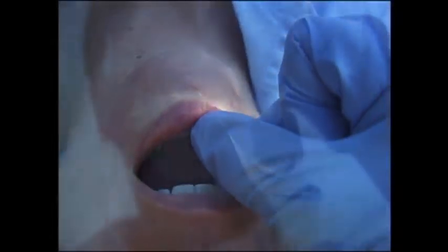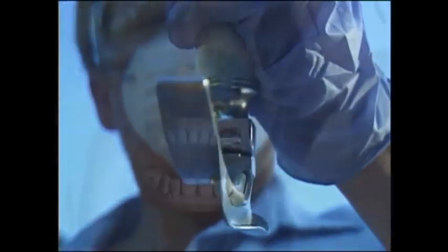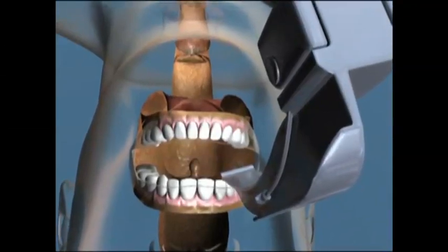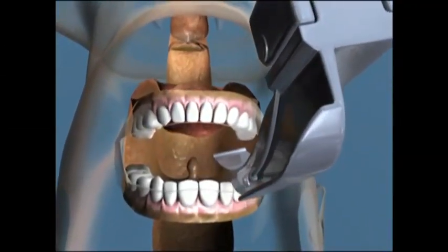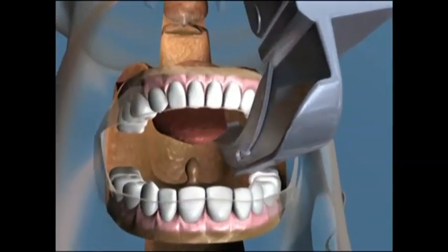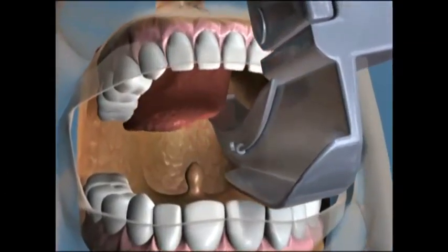While opening the mouth with your right hand, insert the laryngoscope blade with your left hand gently into the right side of the mouth. With a gentle sweeping action, displace the tongue to the left to improve your line of vision.